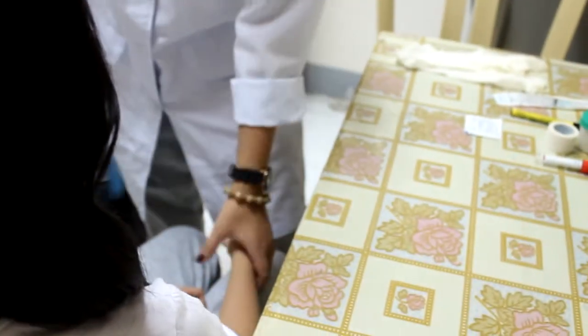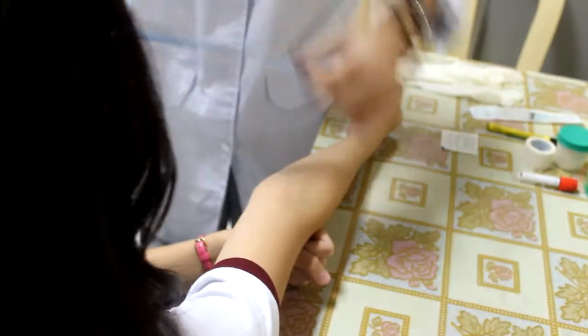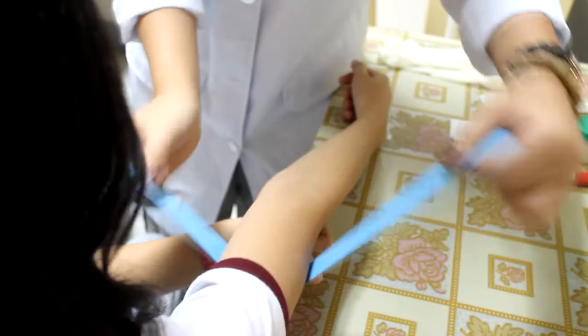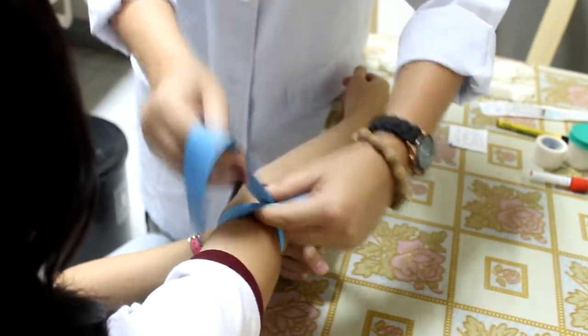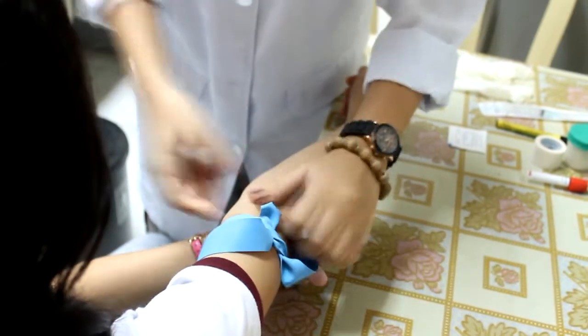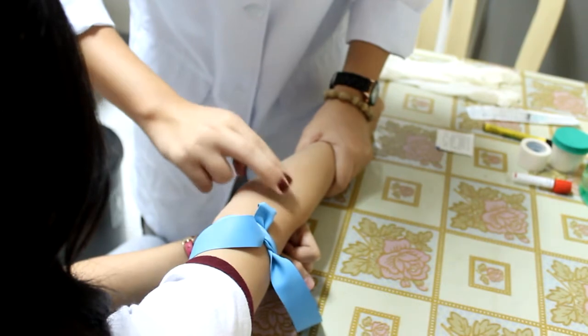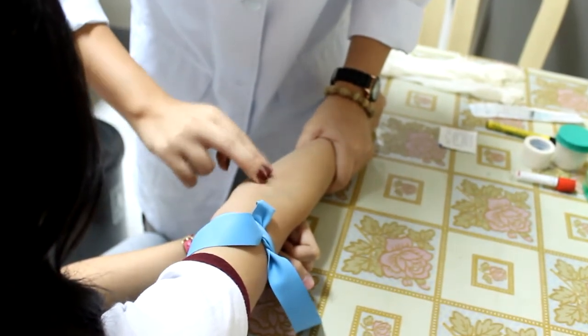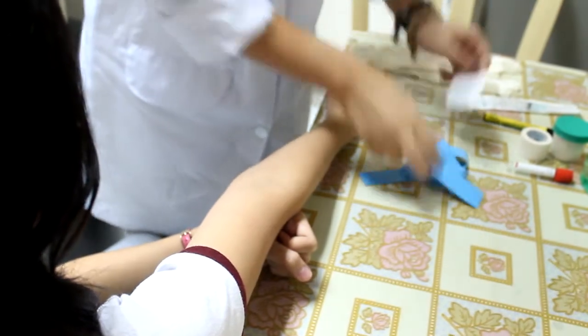Position the patient with the arm extended to form a straight line from shoulder to wrist. Apply the tourniquet 3 to 4 inches above the collection site and select the appropriate vein for venipuncture. When looking for a vein, it's better to have one that you can feel rather than see. Never leave the tourniquet on for over 1 minute. Release the tourniquet after selecting a puncture site.